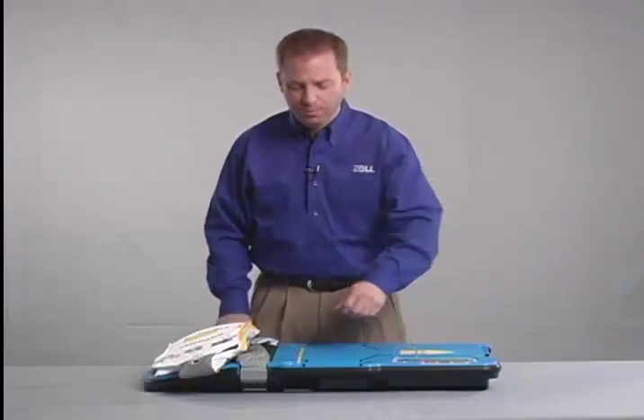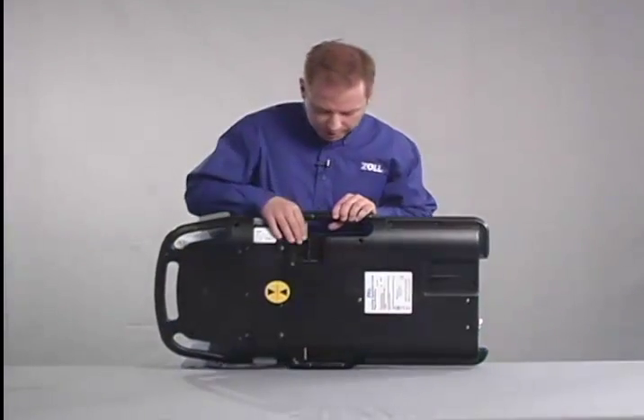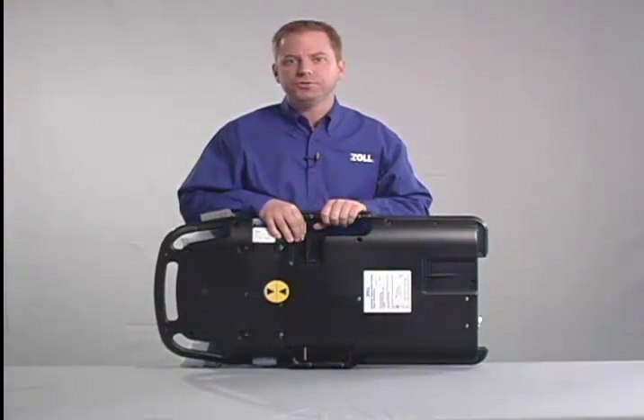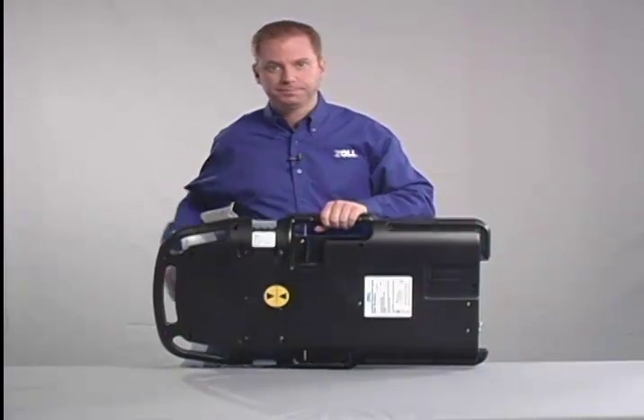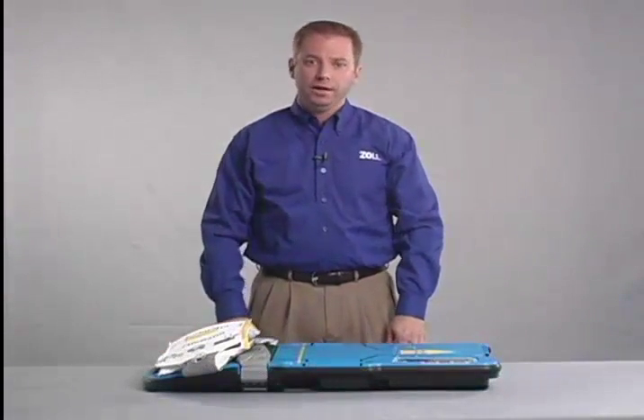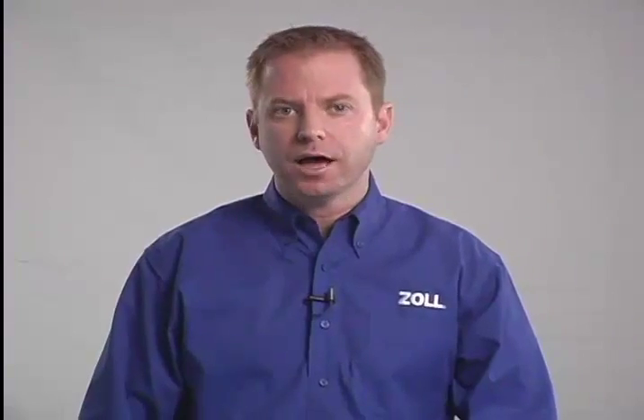There are two vents on the back of the Autopulse. It is important to make sure that the vents do not get blocked with clothing or bedding. Although the Autopulse can work in the rain and other wet environments, do not allow it to be submerged in water. Consider it water resistant, but not waterproof.